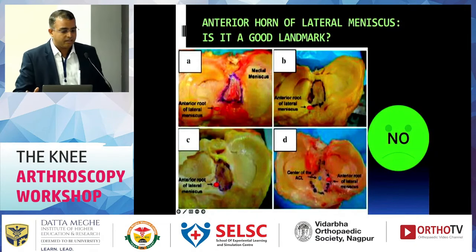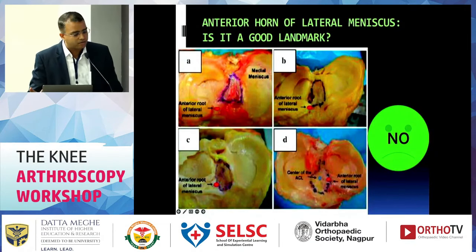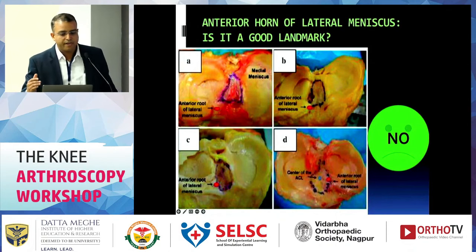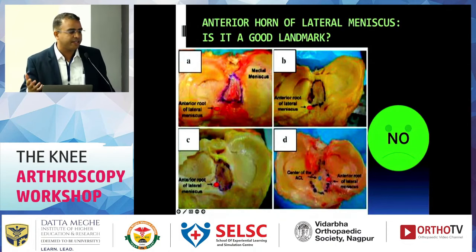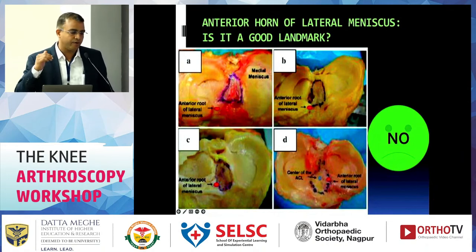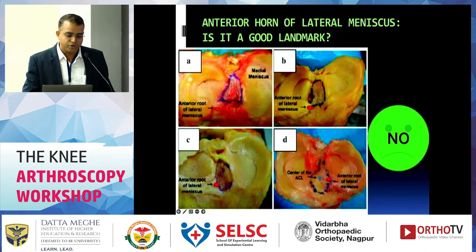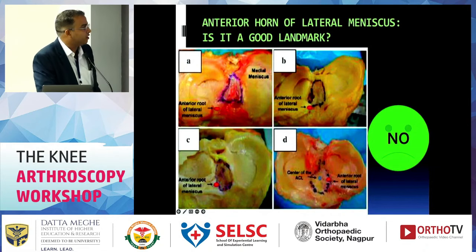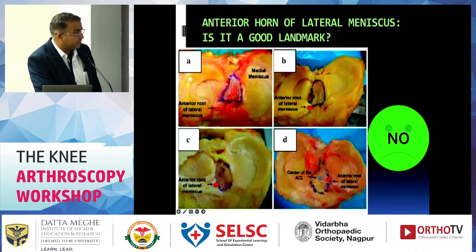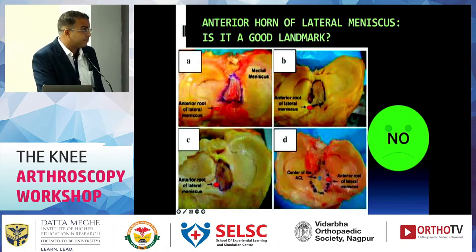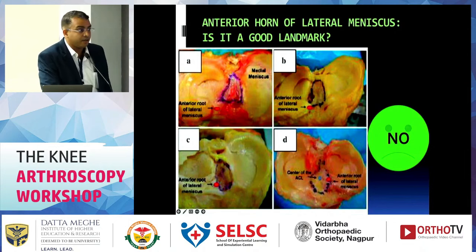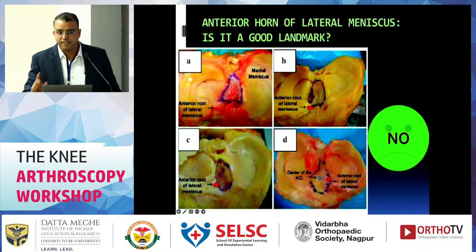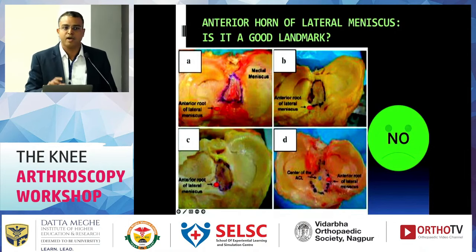Can a single landmark be relied upon? No. The anterior horn of the lateral meniscus is an easy landmark visible during arthroscopy, but in different knees its position relative to the ACL footprint varies considerably — sometimes very near, sometimes very far from the ACL footprint. A single landmark alone cannot be trusted.